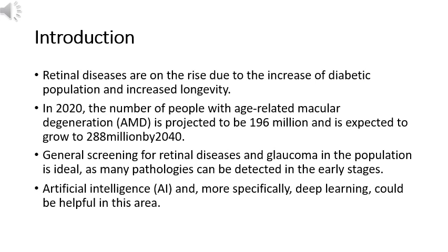Screening for diabetic retinopathy, DR, and AMD is already cost-effective, but there are no published studies to support the case for general screening yet. Retinal fundus images using non-mydriatic cameras, NMC, are currently considered the gold standard for screening DR 3,4 and are also cost-effective for AMD. 5,6. Similarly, screening for premature retinopathy is supported by many papers, showing good efficacy and cost-effectiveness.